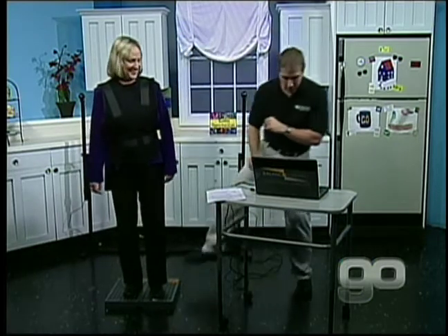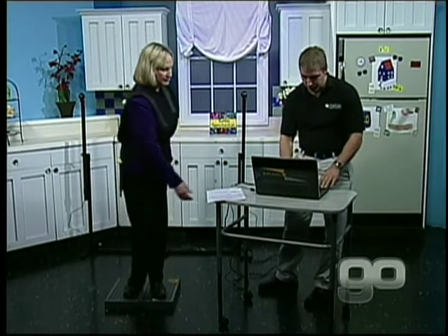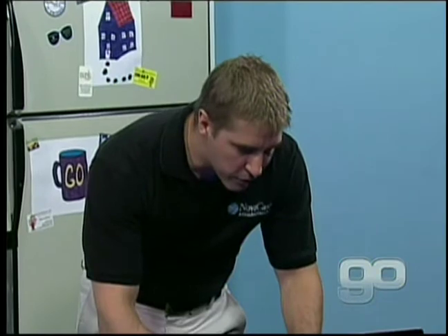Now, what we did is we took measurements from the floor panel and the cameras, and the computer is coming up with a number. And right here it says you're about 94%, which means you're a 6% fall risk. Just don't stand on one foot with your eyes closed. You should be okay. All right. Sounds good. Now, eyes are important.